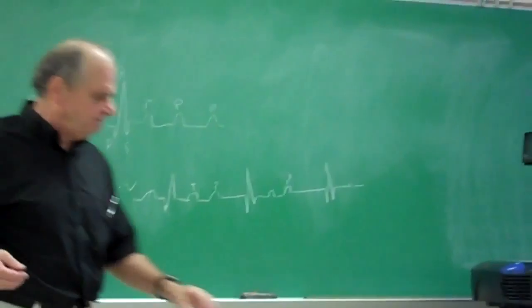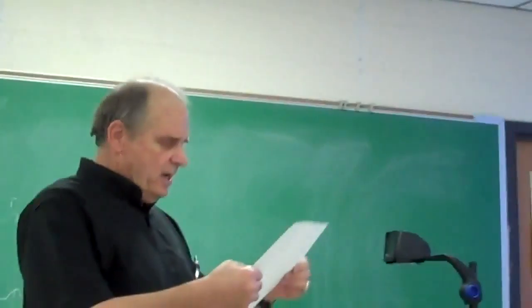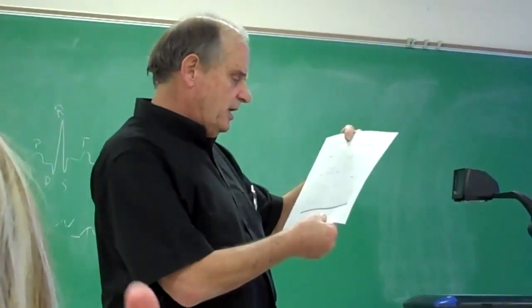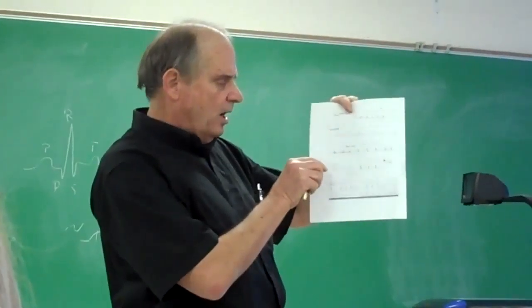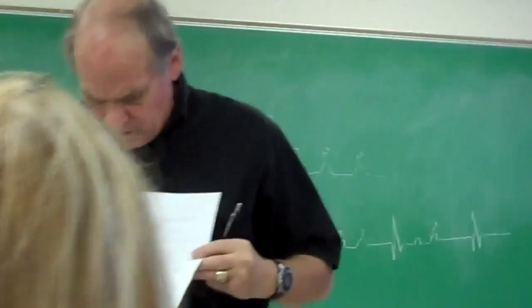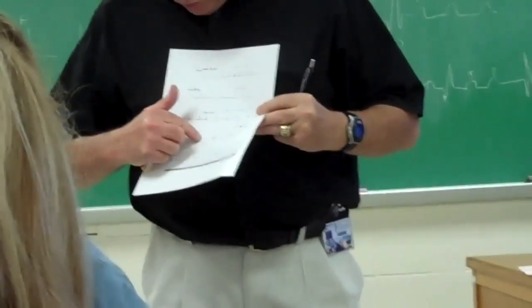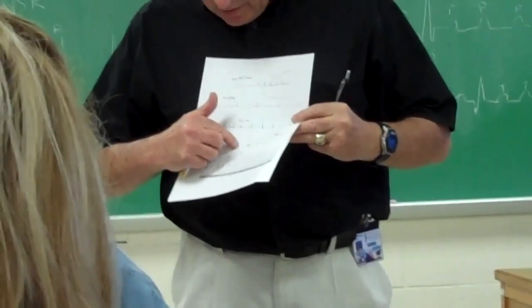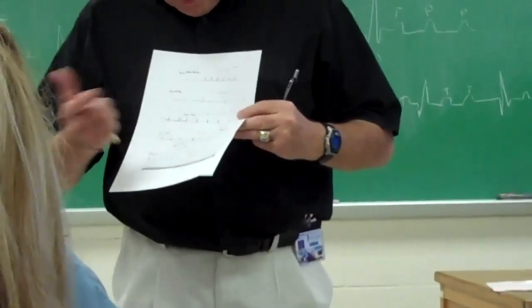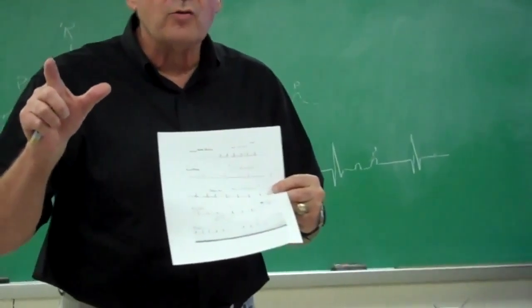All right, let me show you something. It's in your book. Right here is the Wenckebach. Now if you look at this, the PR interval is normal, then longer, then longer, and then it's going to drop. It starts normal, longer, longer, drops one.